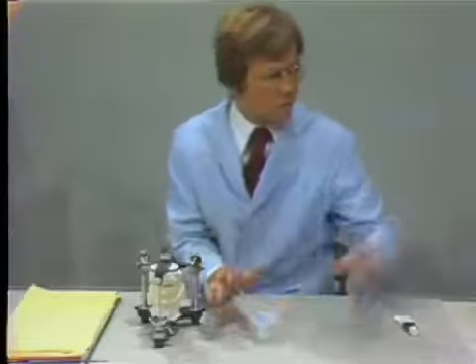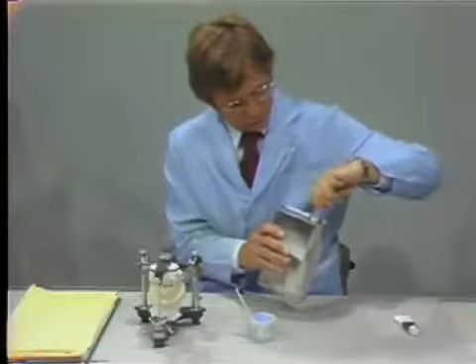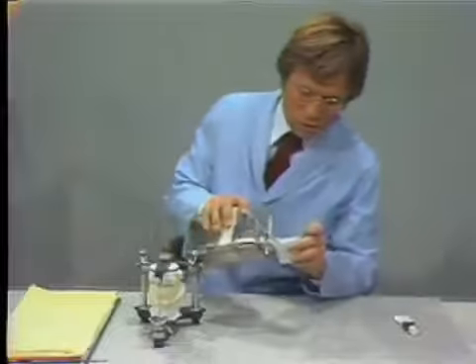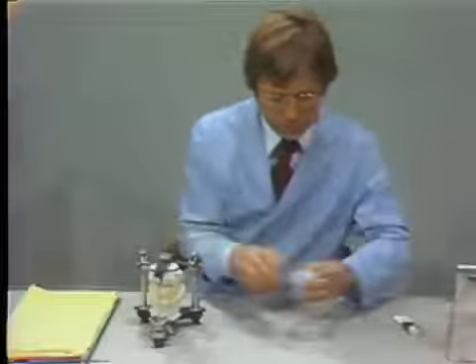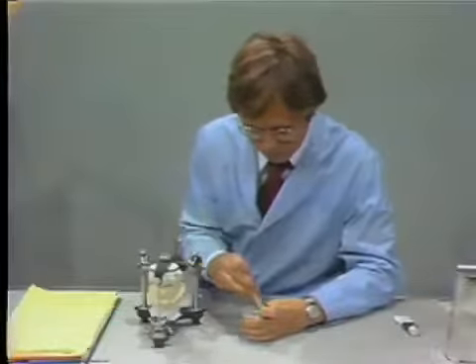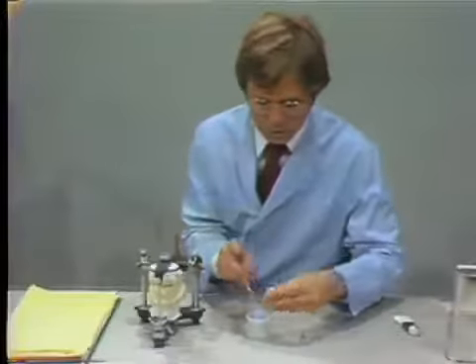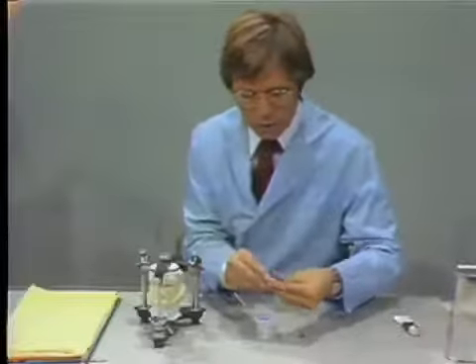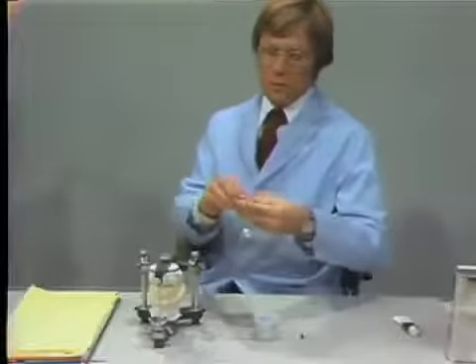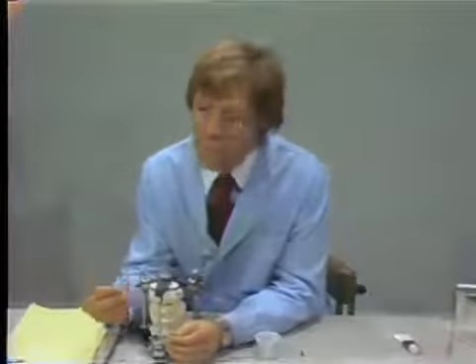This may be just a bit dry under these hot lights. I'm going to add just a touch more liquid, just a couple of drops. Okay, now we don't need much acrylic. If you take one measuring cup full and one liquid, it should be enough for 2 or 3 of you to do at the same time. Now what I'm going to do is to mold it in my fingers.